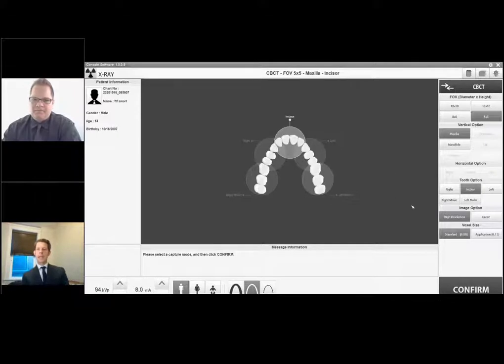Right. And then we do have high resolution in green on here, Paul, but this is not changing the time. This is actually changing our kV and our mA, so our dose over here. So high resolution in green does cut that dose down a little bit.